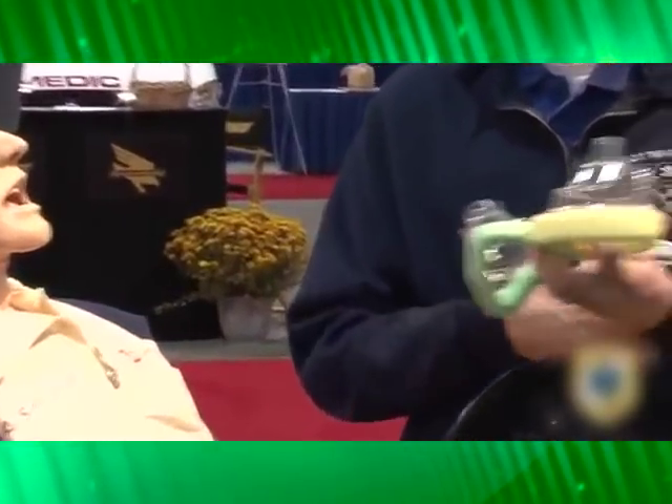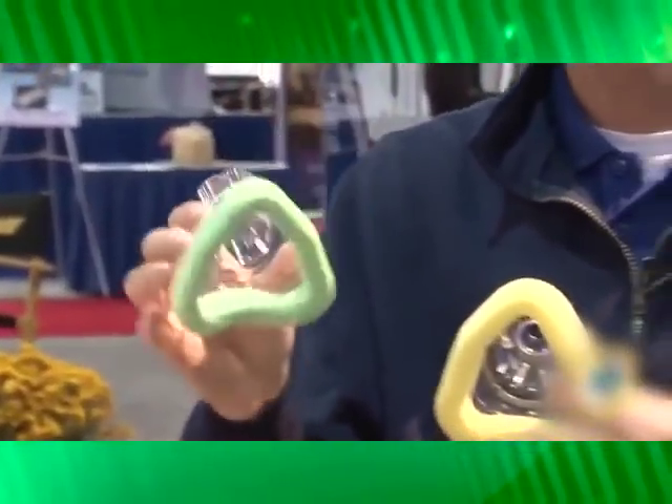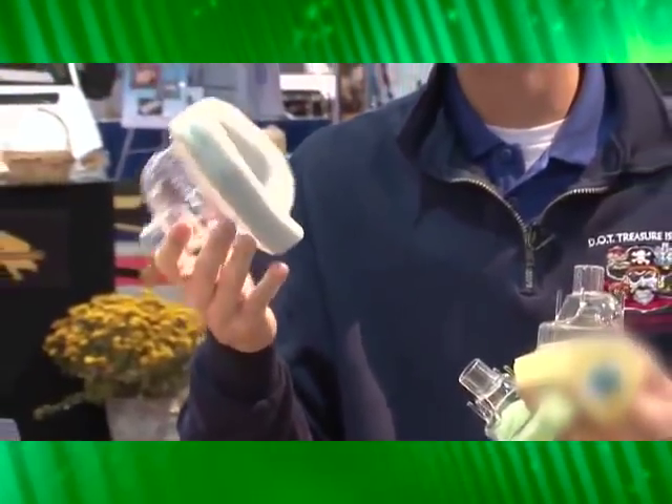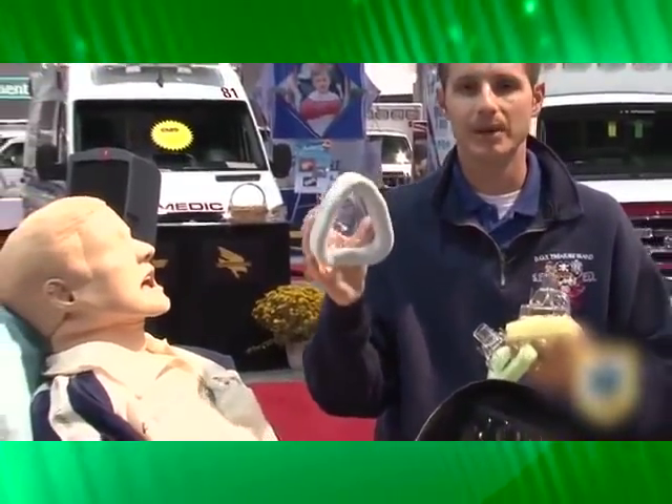These face masks come in three different sizes. The medium, which comes with each circuit, fits about 80–90% of your patients. You have a smaller mask, which works great on elderly patients and also some of your pediatrics. And in addition, you have a large mask, which will fit folks with an overly large head and can also benefit those who are really claustrophobic — it's more of a full face mask size.